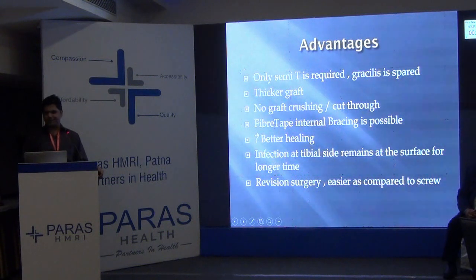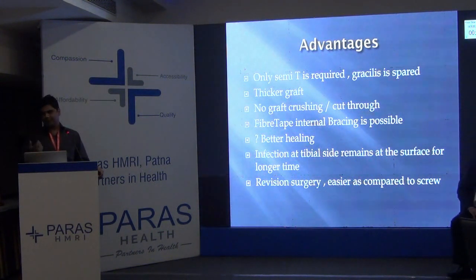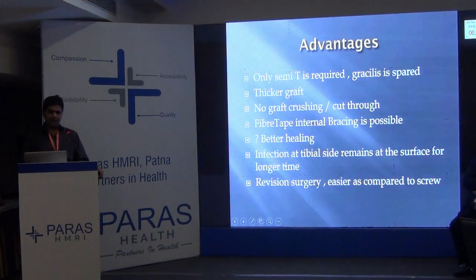Query better healing, this I have just put a query because now we know that the healing is at the mouth. So if the screw is not coming till the mouth, the healing is better in screw also.